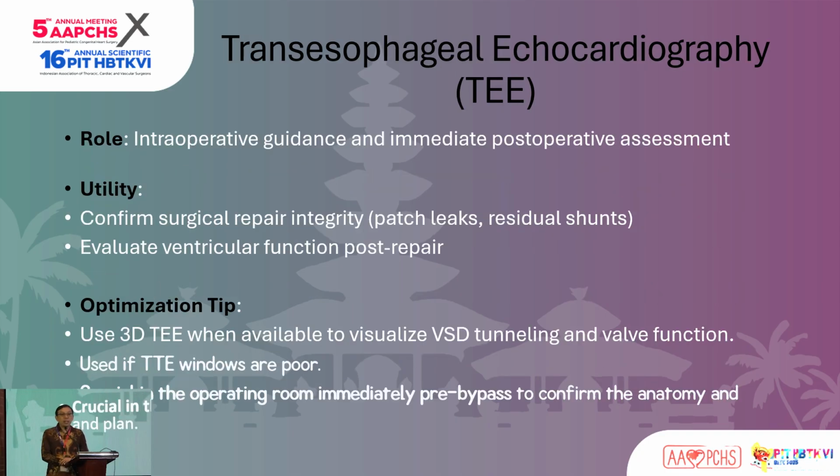The next modality that we can use is transesophageal echo. It guides us intraoperatively as well as post-operative assessment, confirms the surgical repair to make sure that we do not leave any patch leak, we do not leave any residual shunts, allows us to also assess the ventricular function post-repair.